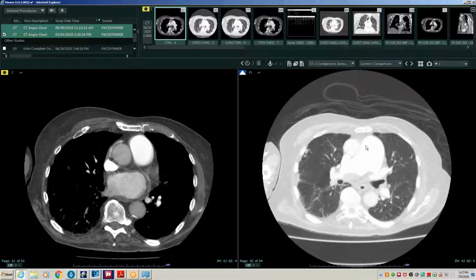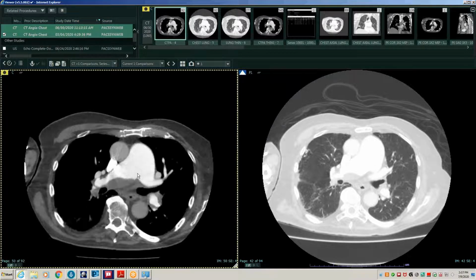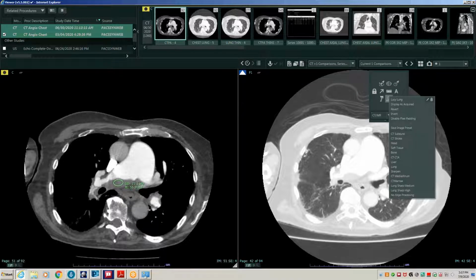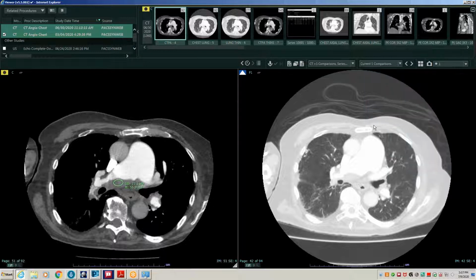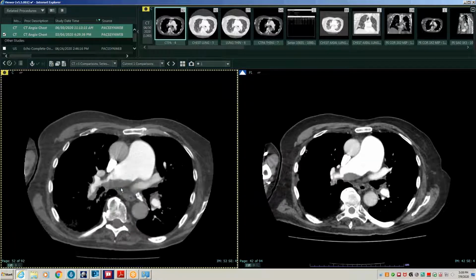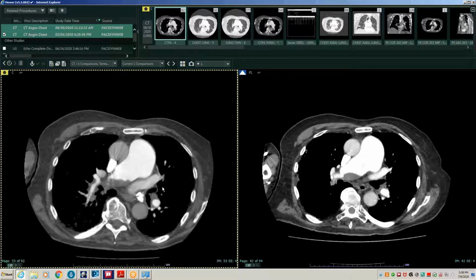In any case, this was seen and reported 3 months ago, and it's not clear that they thought it was pulmonary embolism. I think they were actually worried about tumor. They weren't really sure what it was, and then we got another CT 3 months later. So then we have this CT, and now this filling defect is quite a lot larger than it was before. If I put it back in the soft tissue windows, this is quite a lot larger. There are no new filling defects distally, and he has more inflammatory changes in the lungs, a little bit more consolidation.